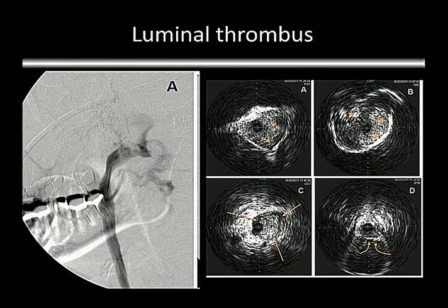This was a challenging case we saw, and I put the IVUS up here. I didn't know what this represented, and you can see that there was old thrombus in there. Old thrombus. It was hard rock, like, I was able to flush a lot of it out. I was unwilling to go up there and put a stent. At this point in my career, I'm not ready to do that. But when we got down to the bottom, we found a valvular stenosis right here. But we got this thrombus out, and we got this flowing again. It's not the ideal way to do it, I must admit, but I think that was useful.